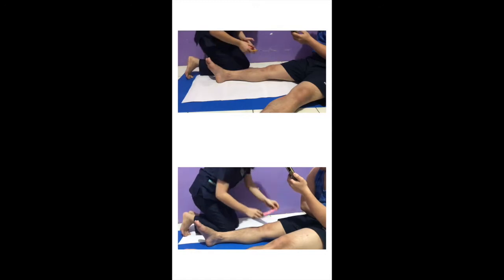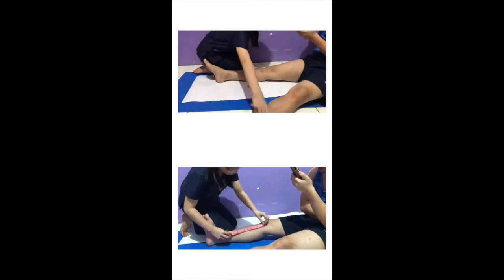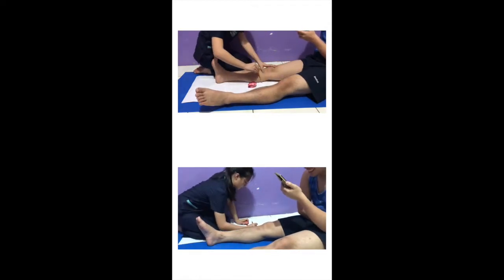First, make sure both feet are clean. The patient should be in a long-sitting position. Make sure that the legs are straight. Place the cartolina under your patient's leg.